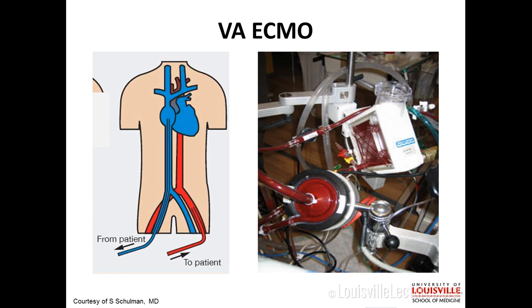I'm delivering the blood right here. How does it get to the head and neck? Nobody knows. It does. Usually these patients are lying flat, and it's kind of remarkable because I'm delivering the blood right here, yeah? And so it should be all going down to the lower extremities. But you actually do get retrograde perfusion of the head and neck, which is pretty cool.